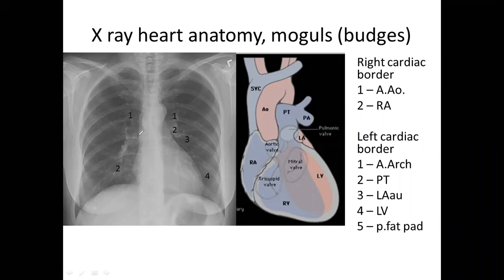If it's slightly visible, it is okay. But sometimes we may see a very significant bulge of the first arc. In this case, we will think about pathology. If it stands out from the vertebrae for a few millimeters, up to 5 millimeters, this is fine.